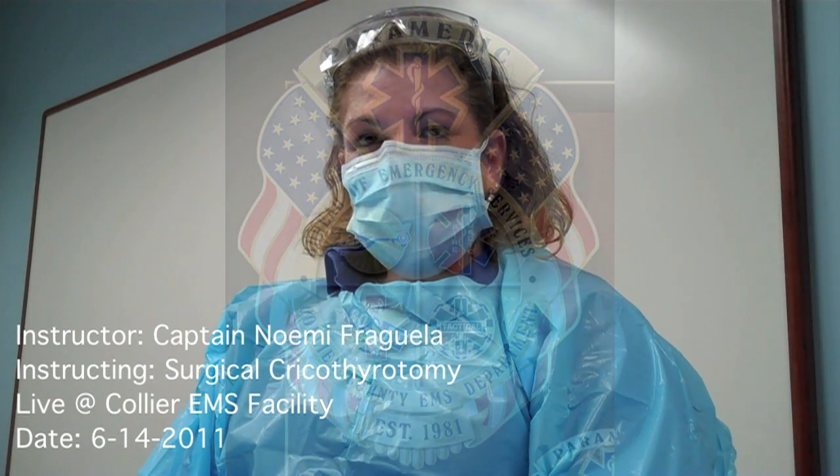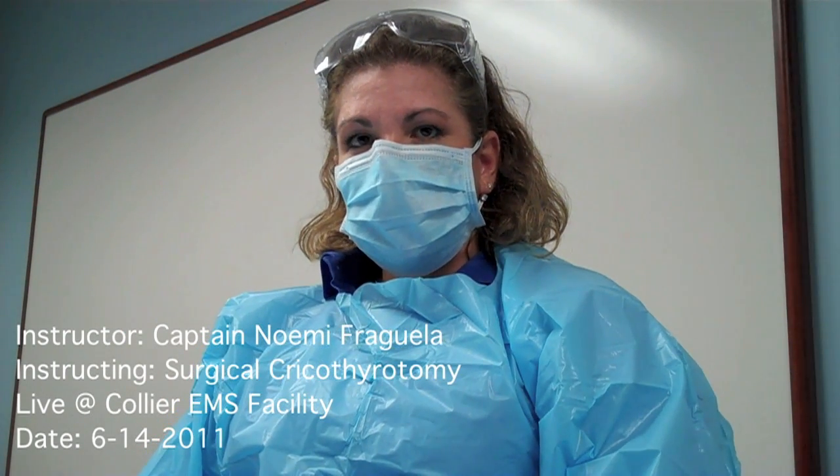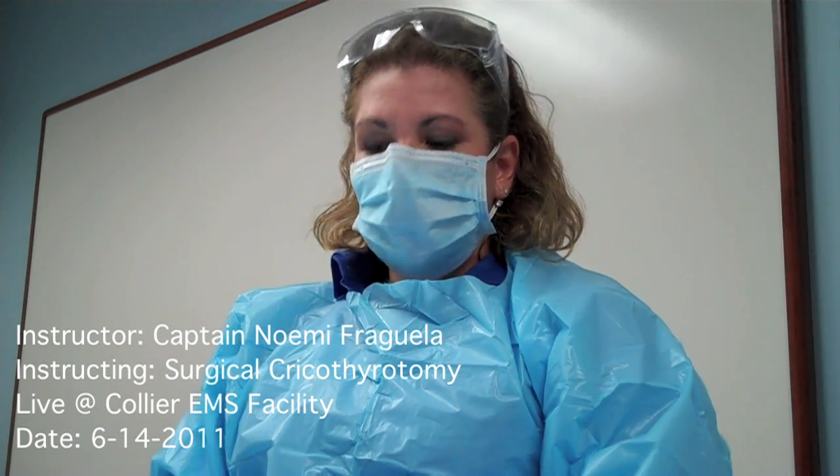Hello, my name is Naomi Freguel. I'm a training captain here in Collier County EMS, and I'm going to be discussing how to do a cricothyroidotomy on a pig throat.